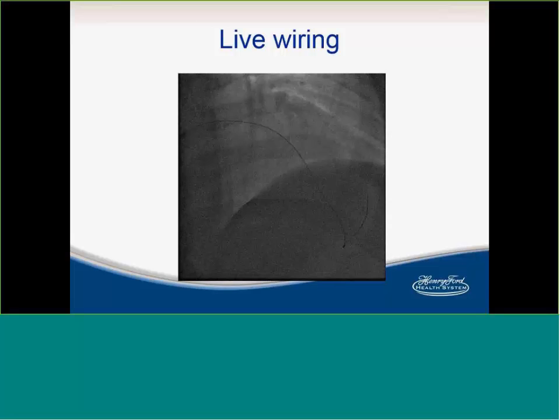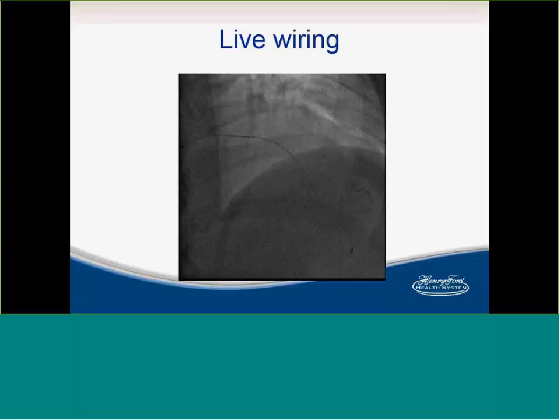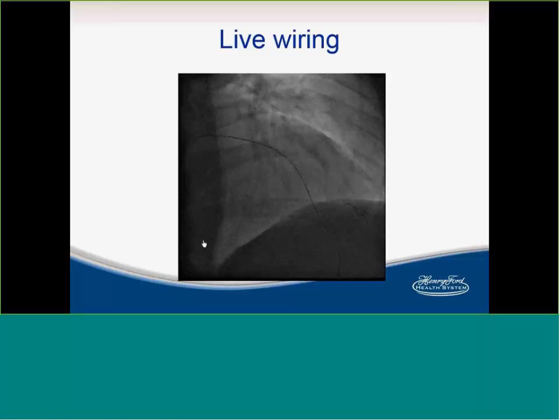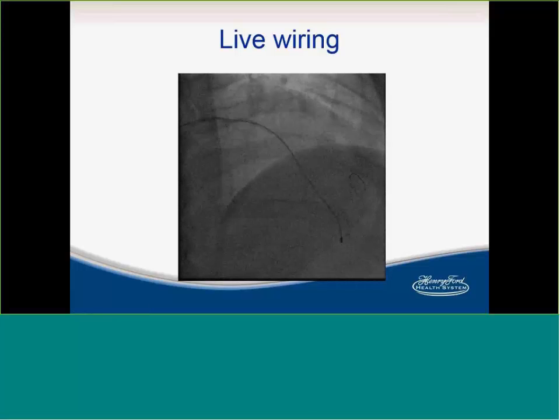Exactly. In the epicardial, again, I advise the audience not to attempt to cross them before they have 50 to 100 experience in septal collaterals. And the first attempt in the epicardial collateral, let it be in a patient post-op. And actually, if you want to have a proctor, I think you should have a proctor with you the first time.